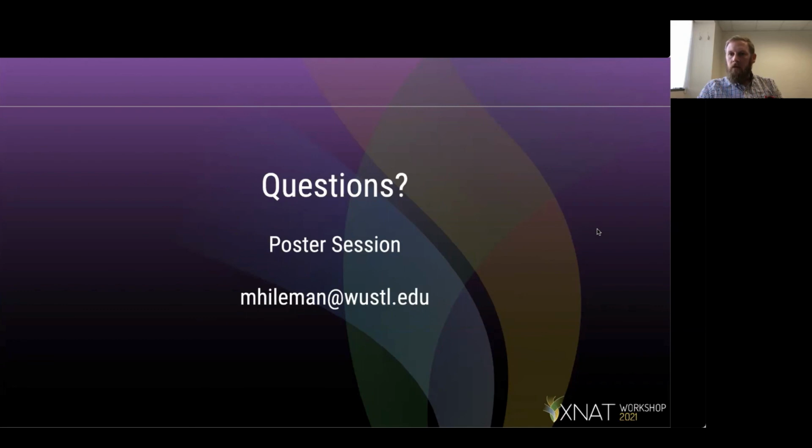So what do we have here for questions? How do you profile incoming studies into a specific XNAT project? Stepping away from CTP to utilize DQR, how do you envision profiling incoming studies? Right now, that's a part of our cohort discovery process, where we come up outside of XNAT with the studies that we want, and then that's the list that we hand to CTP. So it would be the same with the DICOM query retrieve plugin. You can do bulk uploads with DQR, which I'm sure they'll get into.